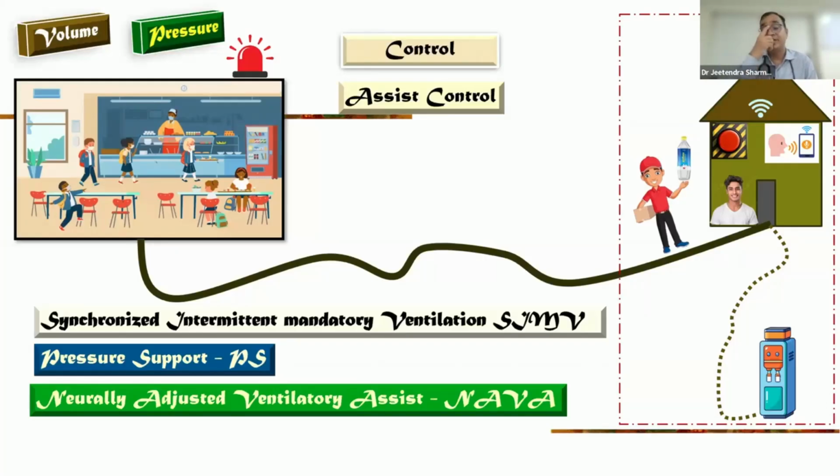That is the most advanced form of ventilation, like a during-breath ventilator correcting the necessary requirement to the patient. So this is the concept, otherwise I will not go into the detail. With this analogy, the concept of basic and advanced modes, I hope everybody understood. Now the question comes, with this concept alone, you can't give the answer in your Viva.